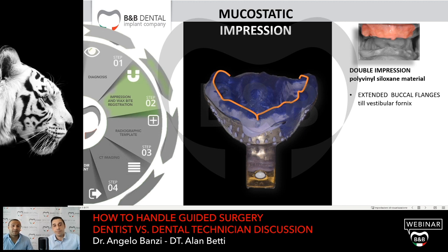Starting with the best material for the impression is a good start, which is required to get a final result that satisfies the virtual implant plan.